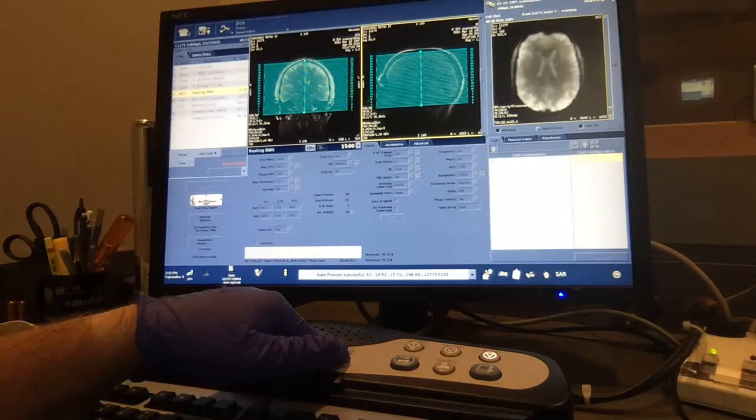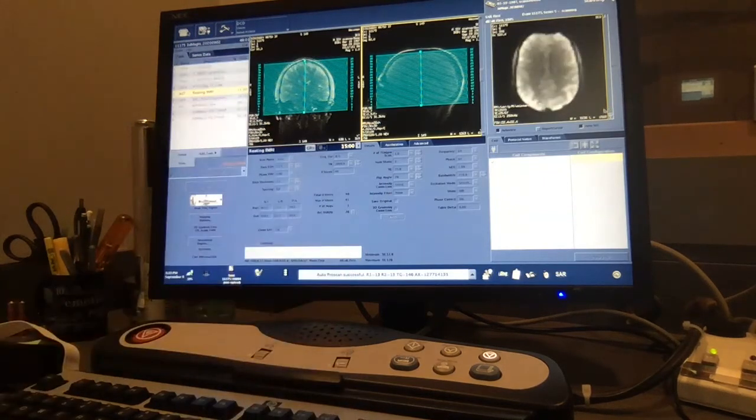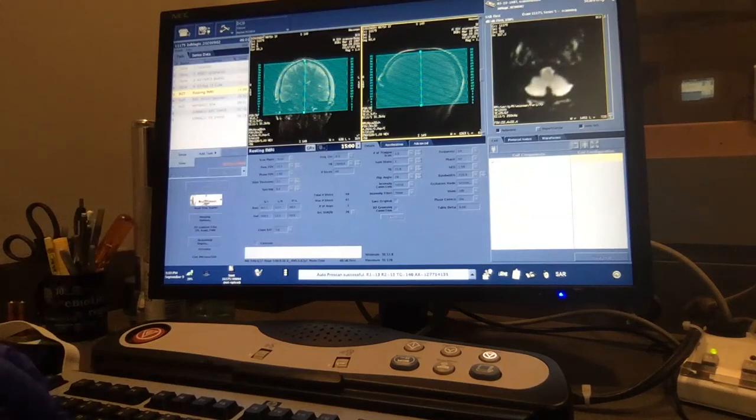You can make out that these are much lower resolution than the images we previously acquired from the structural images. About every 2 seconds, a scan is going to keep popping up here until that full 15 minutes is done. And again, as Dr. Byrne and Alexander said in class, we're acquiring these data very rapidly so we can look at fluctuations in the signal that are related to blood flow. We'll talk about that more in the course when we're covering fMRI, but it's essentially why we want to acquire these images so quickly.